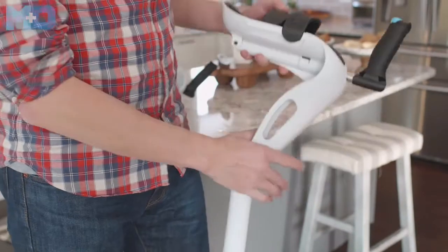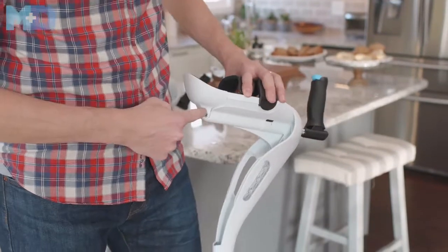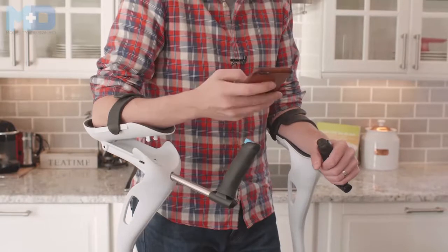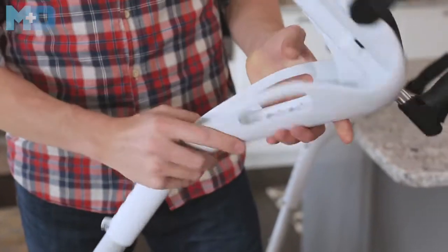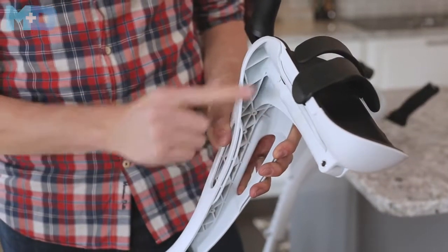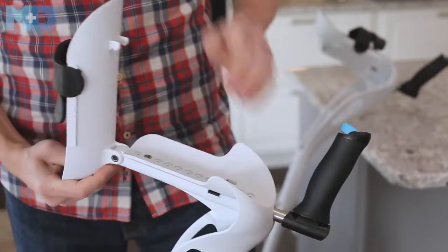The cradle comes default in the box in the locked position, meaning it doesn't rotate. You can see the hinge here. It won't rotate up and out of the way. The reason why it rotates is so you can do things like brush your teeth or other daily activities without having to get out of your crutches. To unlock your crutch, you simply push from the back side, like so, on the slide lock until it's flush, and then the crutch cradle can rotate up and out of the way.